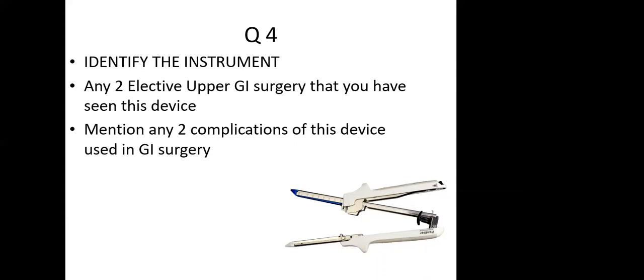No, the whole of the stapler. Now, this is not a full metal stapler. Full metal staplers are reusable and autoclavable. This kind of device is ideally not reusable. This is a one-use stapler and you should discard it. But what we usually do is sterilize this not by autoclaving, but by plasma sterilization or even chemical sterilization with glutaraldehyde, and then use it by changing the cartridge. Usually in a cost-constrained environment we do that, but ideally this should be a disposable stapler.